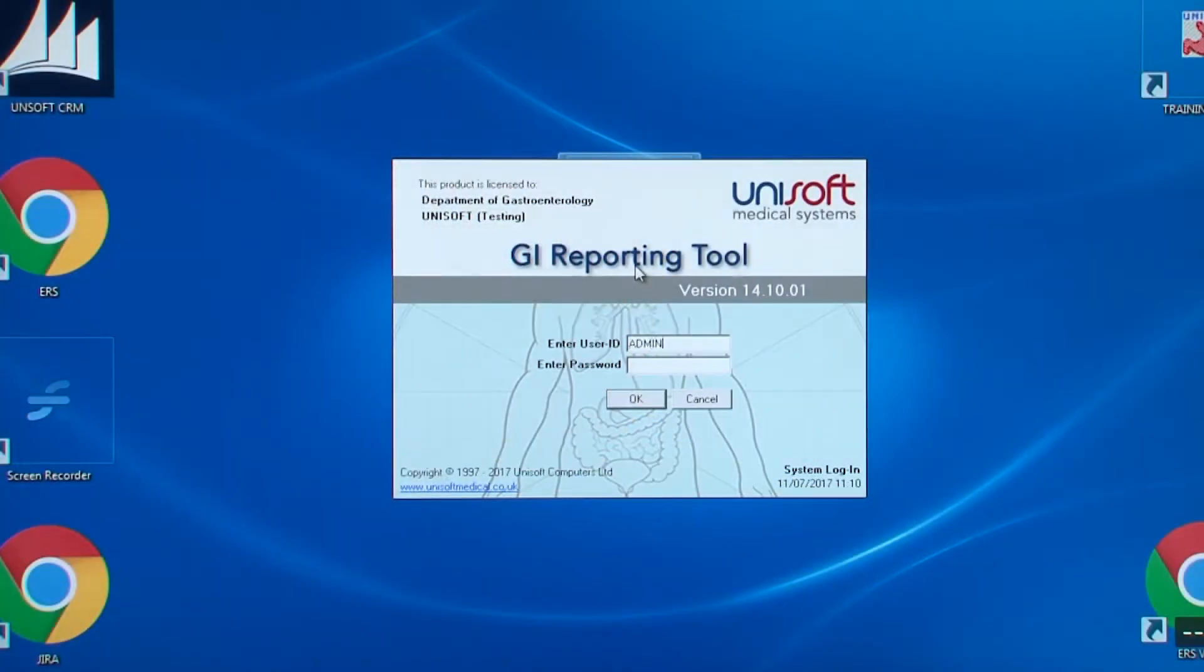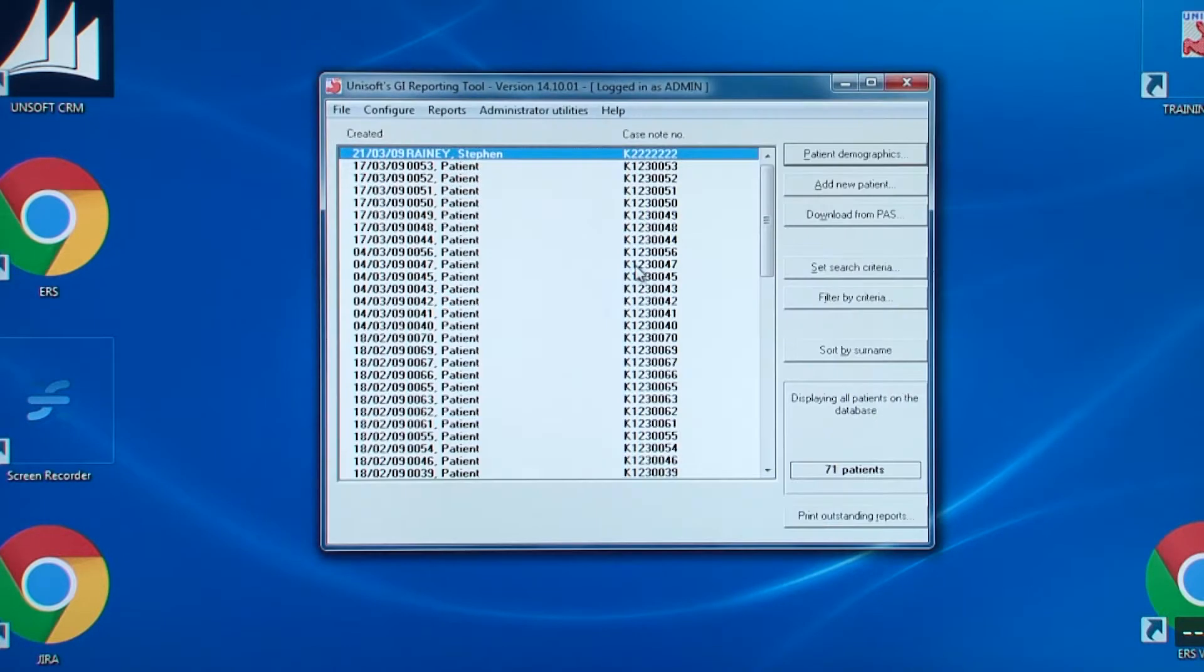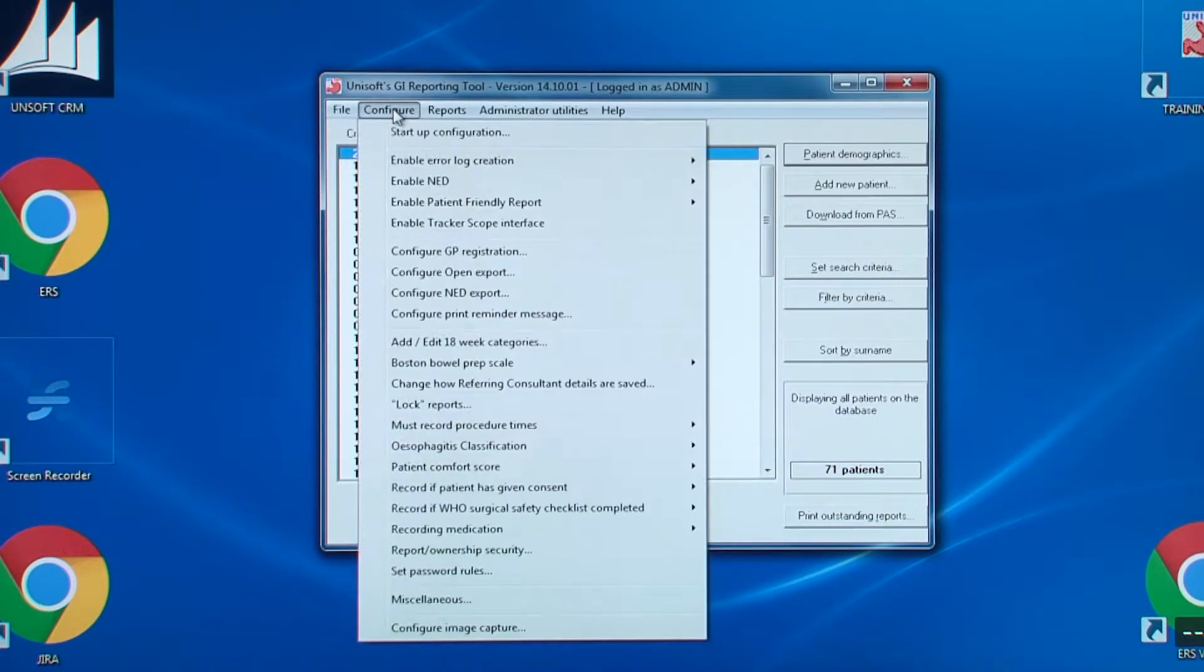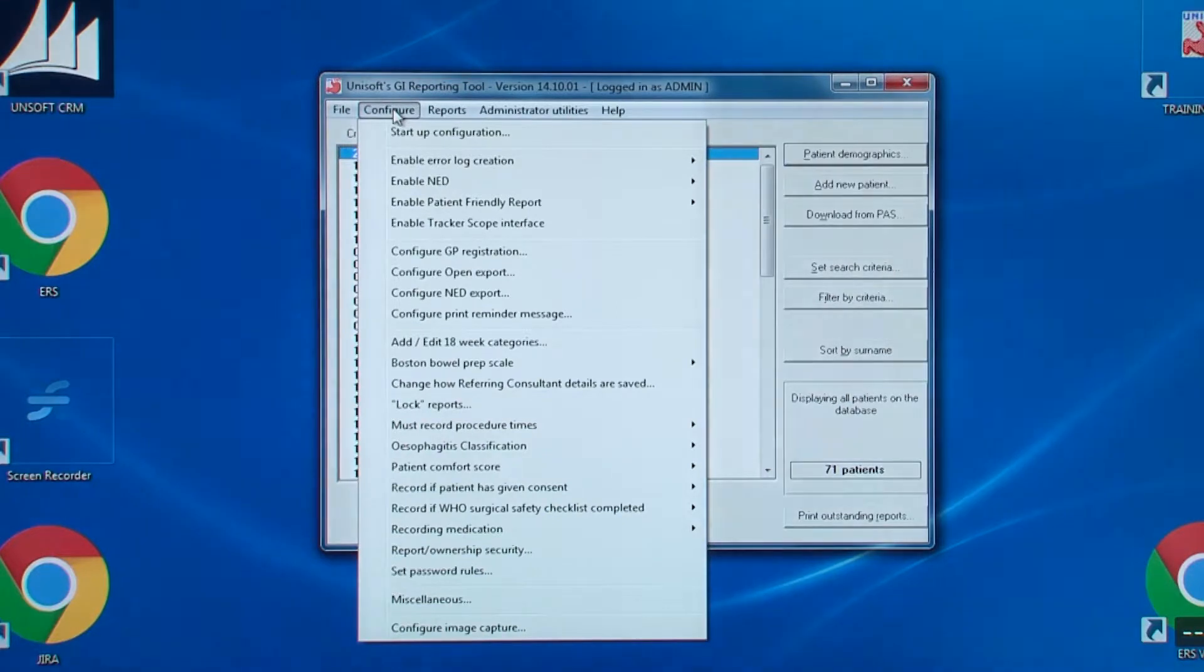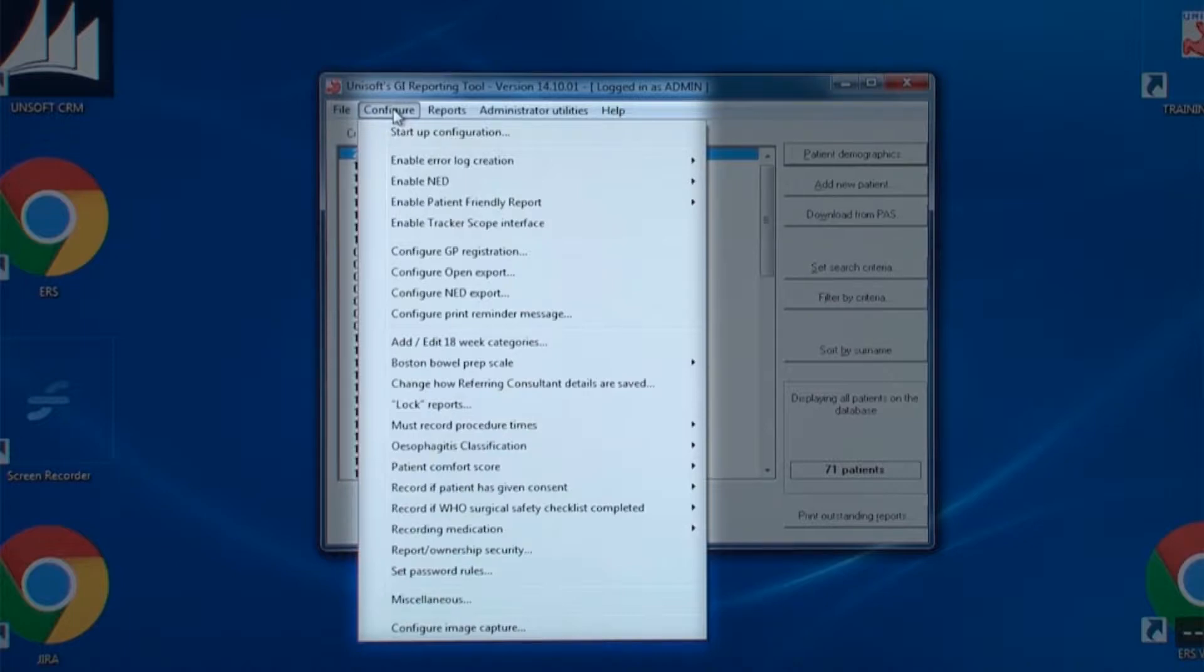When admin logs into the software these are the options that appear under the configure menu. This is showing version 14 of the software, the NED compliant release. Previous versions will have the same options but they are shown in a different order.